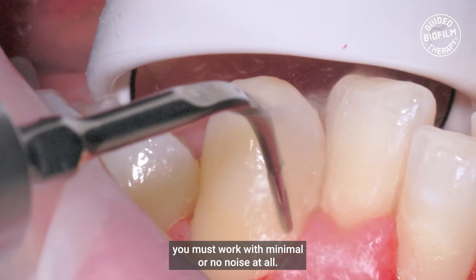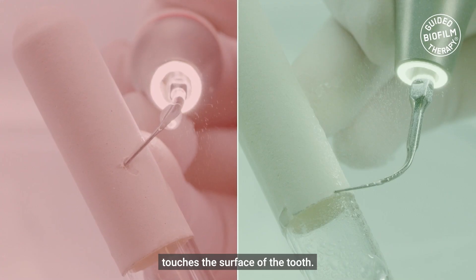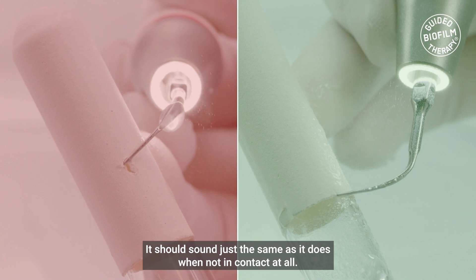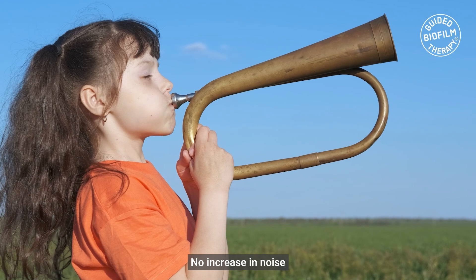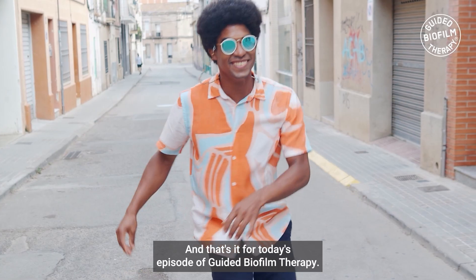We must work with minimal or no noise at all. The sound shouldn't increase when the instrument touches the surface of the tooth — it should sound just the same as it does when not in contact at all. No increase in noise is one of the best indicators that the correct technique is being used.